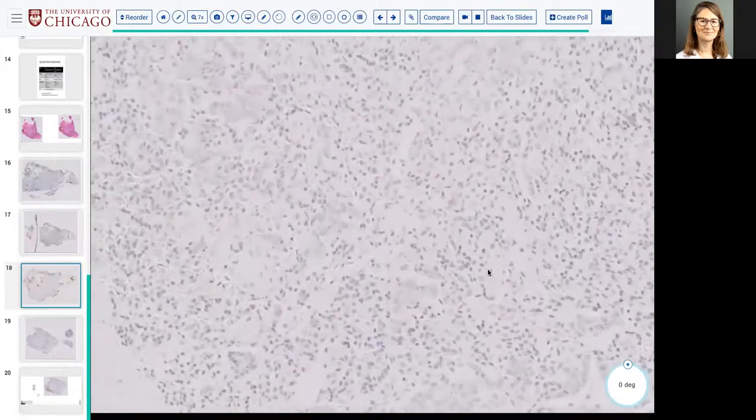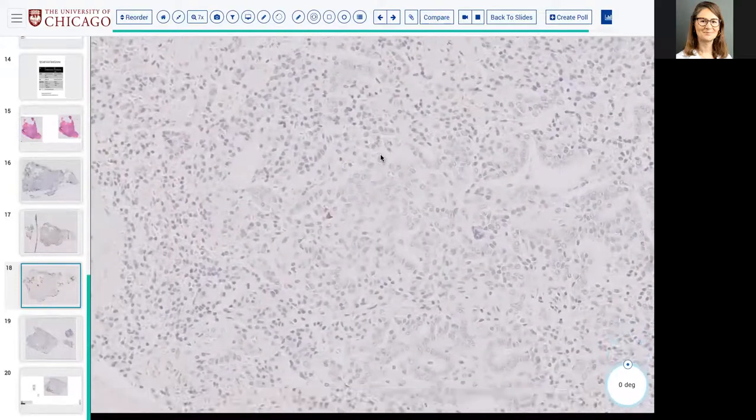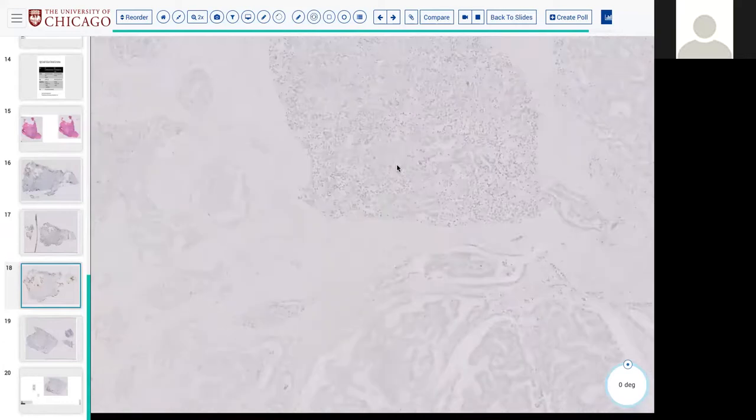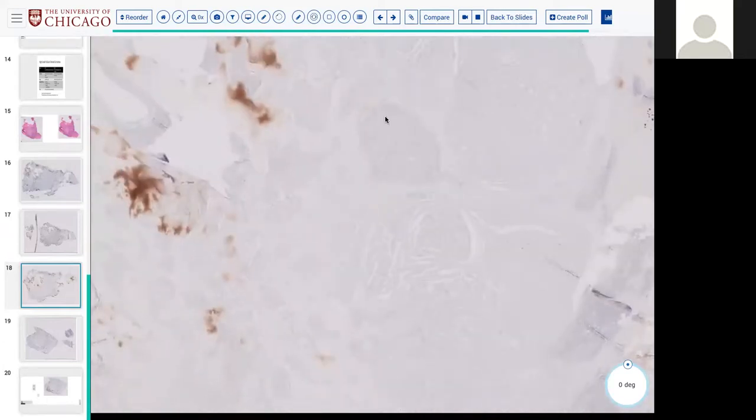So, okay, metastasis potentially from where? We don't know. Actually, I was going to say GYN. Ryan just said that here. Papillary. She's so young, but does she have a teratoma? She has nothing else in her body. She has this tumor in her thyroid, and she also has metastases to neck lymph nodes. So following the pattern of salivary, something like that with the intestinal type.